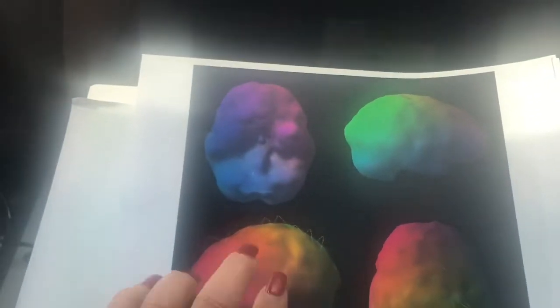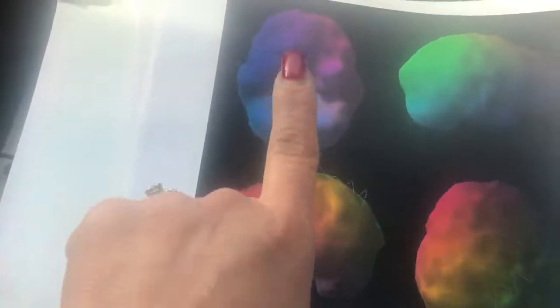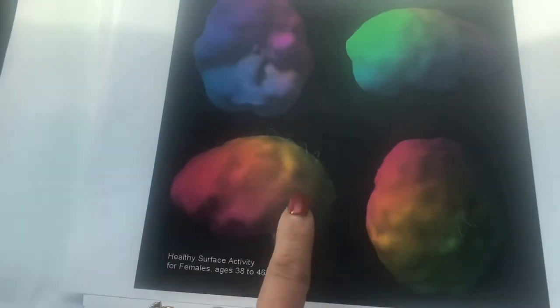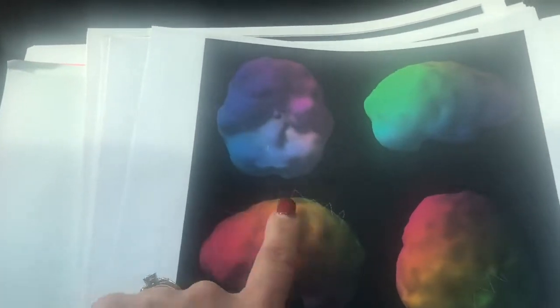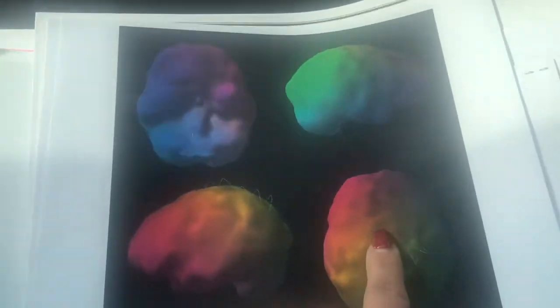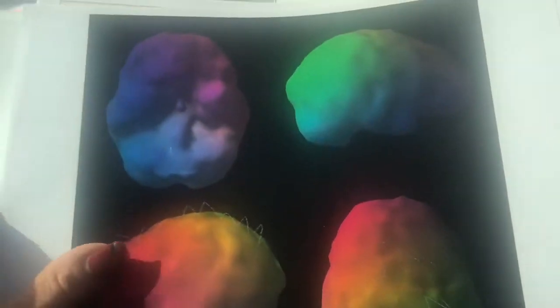On this scan, you can see this is like the bottom view of the brain looking up. This is a side view, and as you can see, it's mostly smooth, not jagged. This is from the top of the brain looking down, and this is a side view also. So you can see, for the most part, for a female ages 38 to 46, this is what a normal healthy brain would look like.